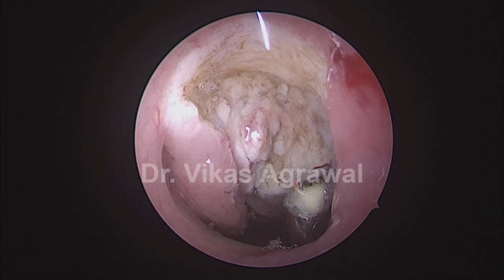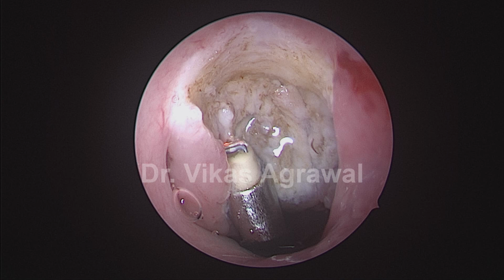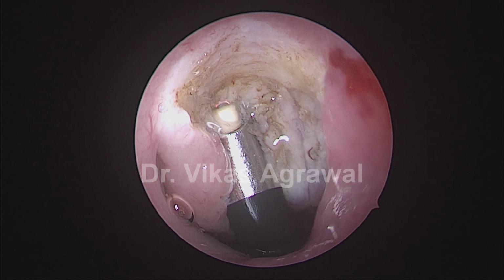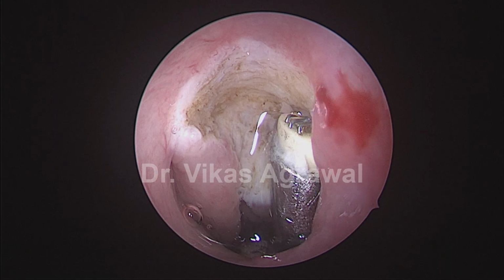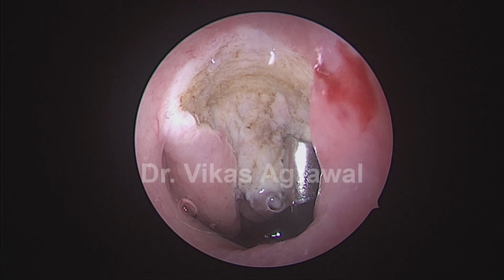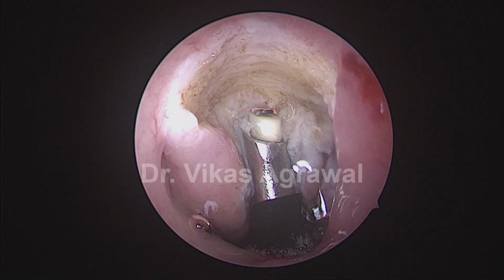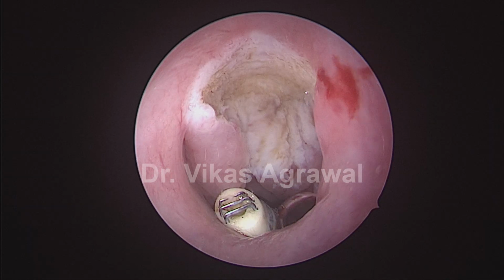Now, as I have debulked, I have got some space and I can see things in a much better perspective. So, important is not to open up the periosteum, only define the periosteum, not to open it up. So, now that superior boundary is completely defined, now we go for the lateral boundary.